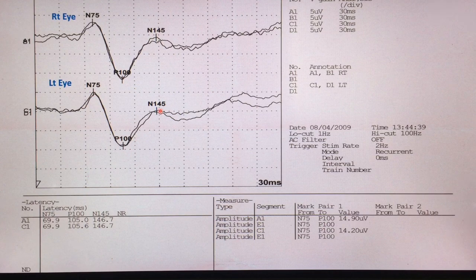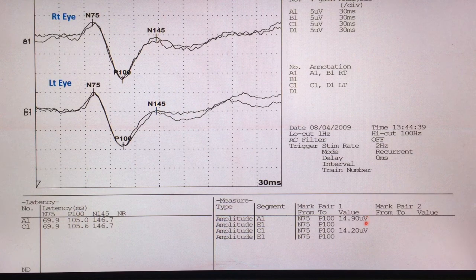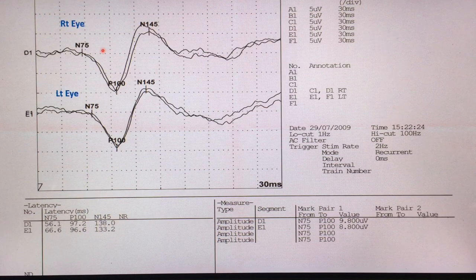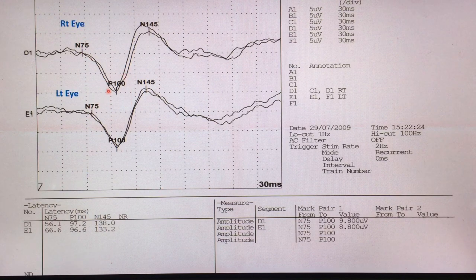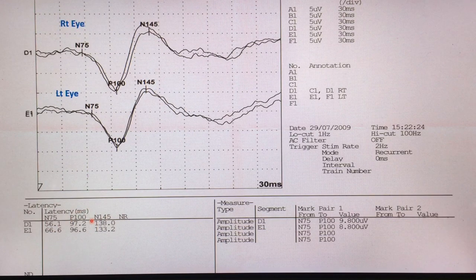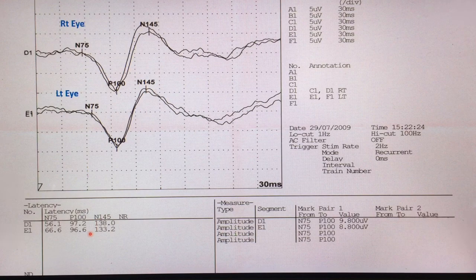This is a very high amplitude waveform — right side 14.9 microvolts, left side 14.2 microvolts. The N75 is not very clear, but P100 latency is very clear with good amplitude. Normal P100 latency: right side 97.2 milliseconds, left side 96.2 milliseconds.